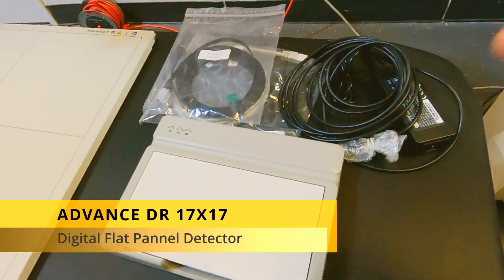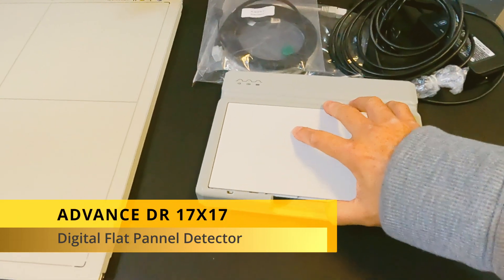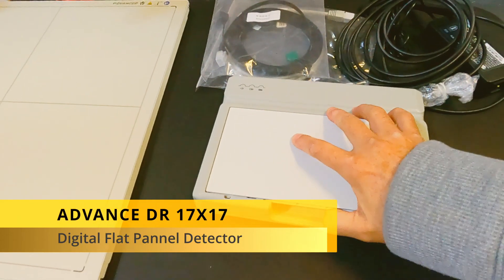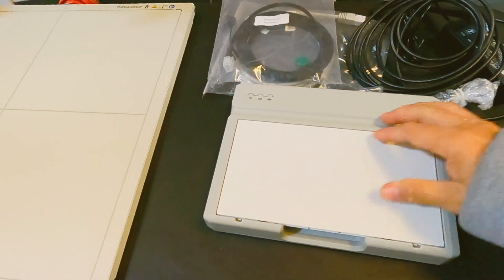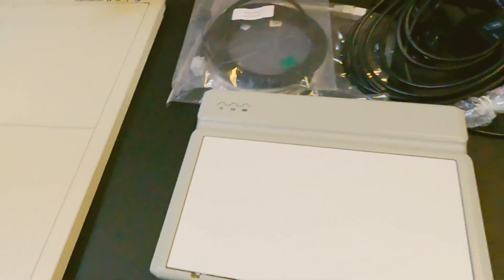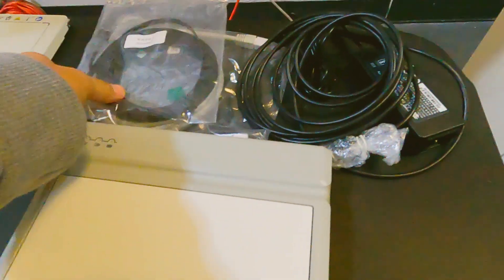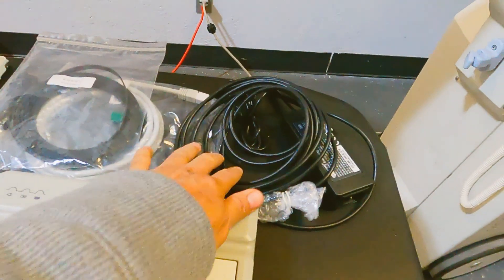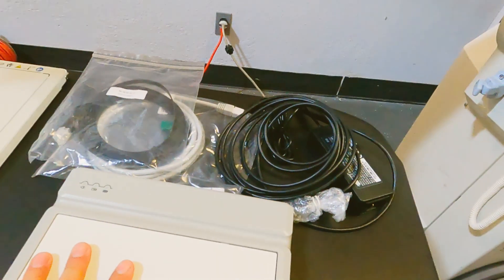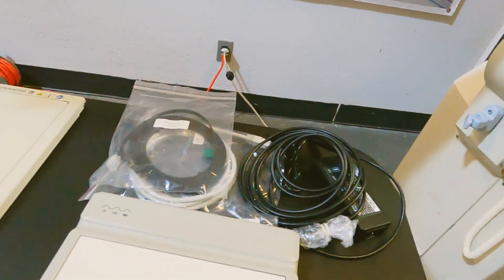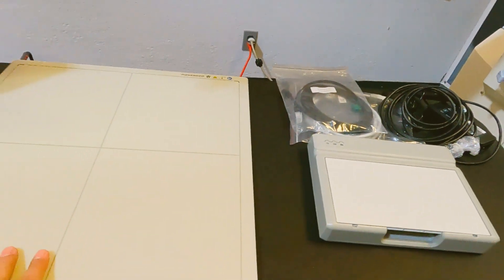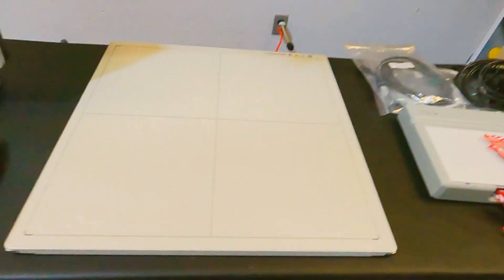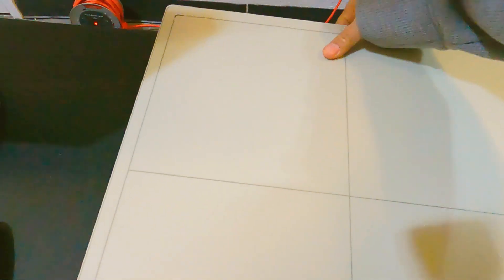This wireless flat panel detector comes with an external battery charger and a set of two batteries, also the communication cables for wire connections and detector power supply, so you can connect the detector to the standard power supply.